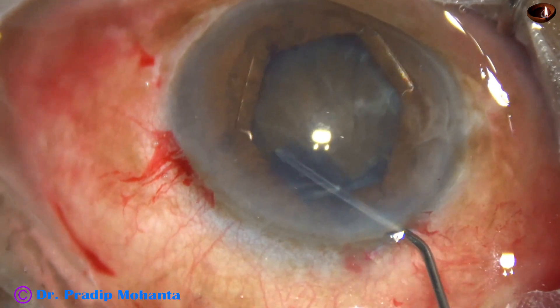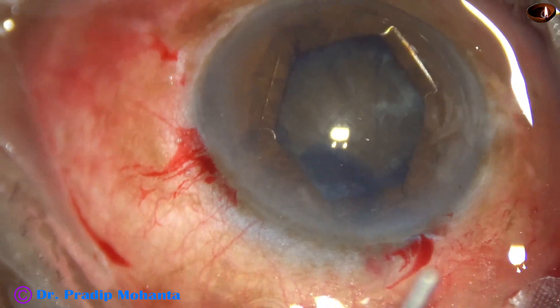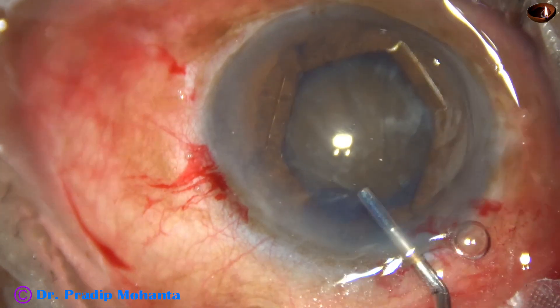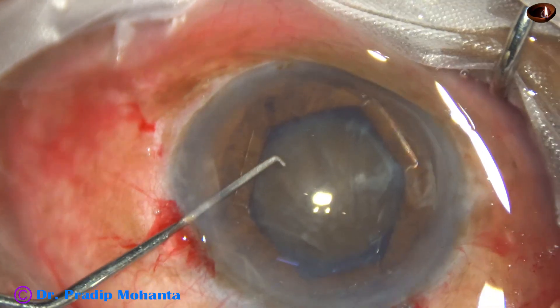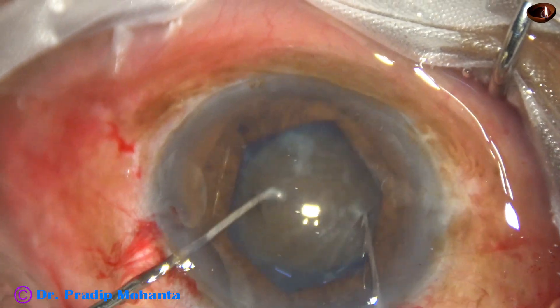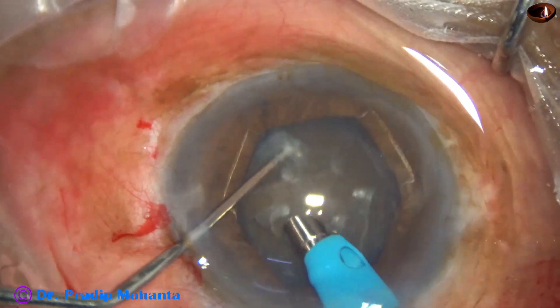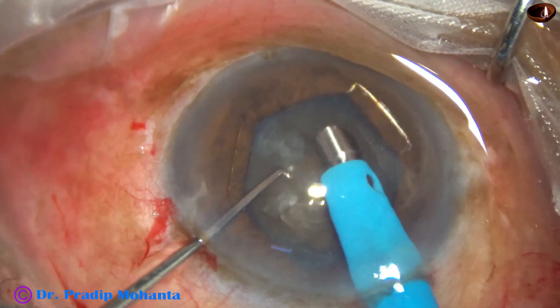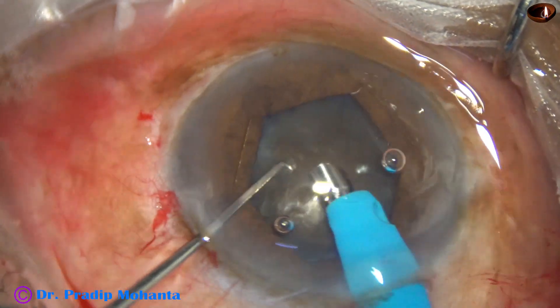Hydrodissection is done at multiple points and small amounts of BSS are injected. Visco is injected again and the nucleus is bimanually rotated. Bimanual rotation of the nucleus causes stress on the zonules.